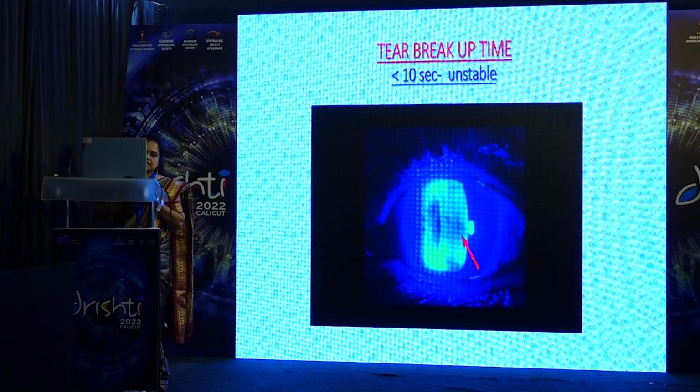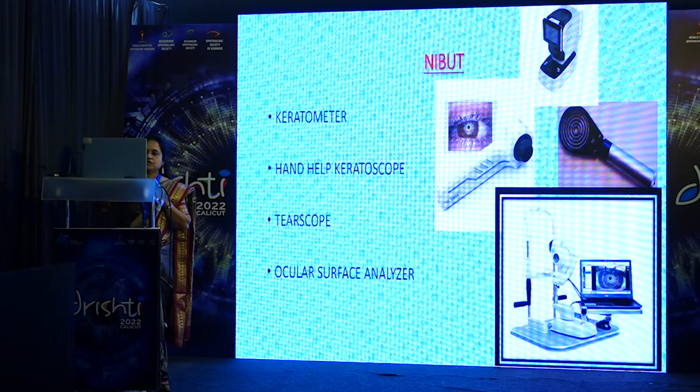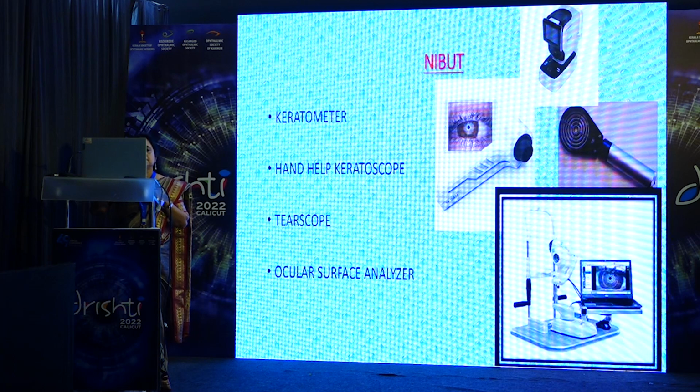Again, if it is less than 10 seconds, the tear film is unstable. If less than 8 seconds, it is supposed to be diagnostic of dry eyes. But we have to know that instillation of fluorescein itself will affect the stability of the tear film, and therefore the non-invasive breakup time is supposed to be the most reliable method to denote the tear film stability, and it can be done with various instruments like keratometer, hand keratoscope, tear scope, etc.